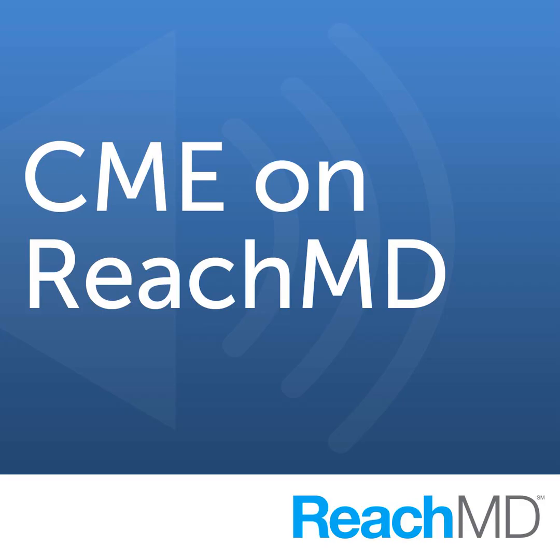On the other hand, please be aware that this is a model in that paper, and not all the patients were characterized by genetics. So we also have a mixture here, but important: keep in mind, using echo or CMR, it's not always about the famous 15 millimeter. One may also have different phenotypes of HCM, as you see here. You can go into the details, that is based on the HCMR registry. The hypertrophy can be localized in different places.